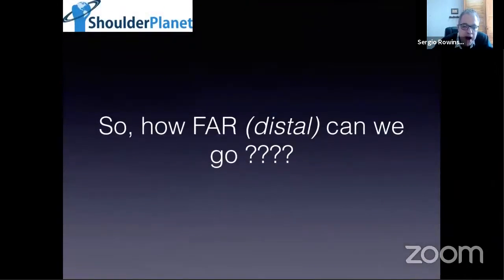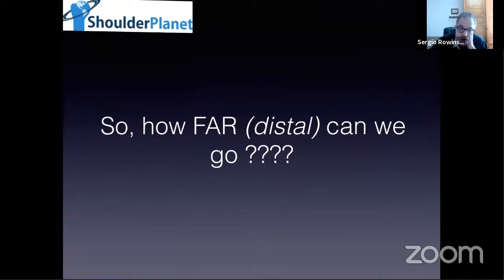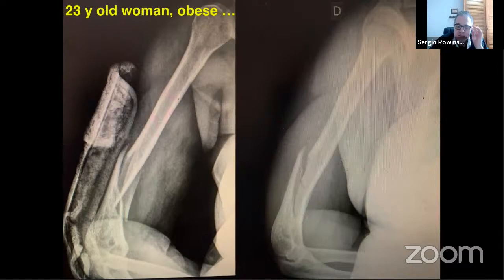So how far can we go? Well, I can go extremely distal with this technique. So let's take a look at this case. This is a very obese lady with a complex distal diaphyseal metaphyseal fracture. If you do posterior plating, there is an extreme devitalization of soft tissues, a very big incision.